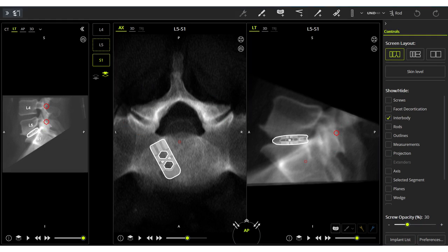Cage. The interbody cage can be selected and positioned on the software depending on the specific surgical technique employed and the patient's underlying pathology. Selection of bone graft type should be considered and can be introduced into the disc space and contralateral facet joint during the surgical procedure. Instruments such as a funnel-shaped cannula can be utilized to deliver autograft or allograft to these sites.